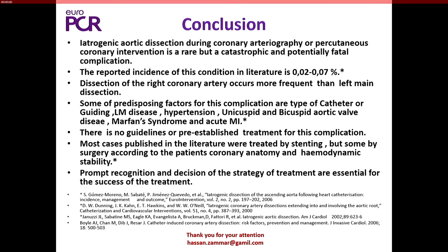And I think it is very smart to find the true lumen, and then you fix the coronary. I don't know exactly what we've seen. We sometimes try to find something in the literature. There are only anecdotal cases of how we can deal with aortic dissections. But at least what we've seen is, if you have hemodynamic stability, you should not send the patient to surgery, because then the result is usually worse than if you do this conservatively.